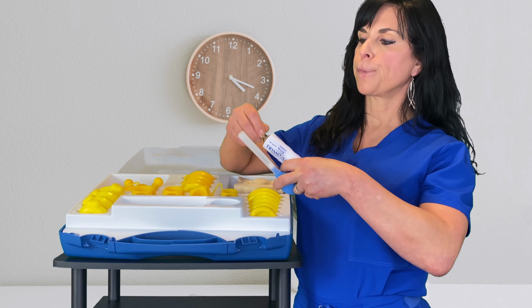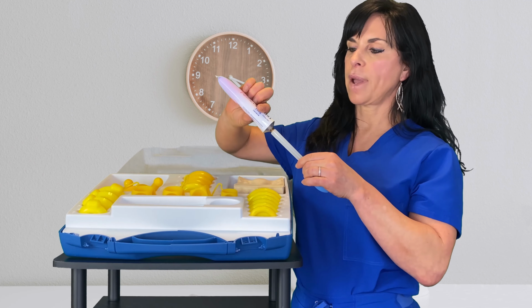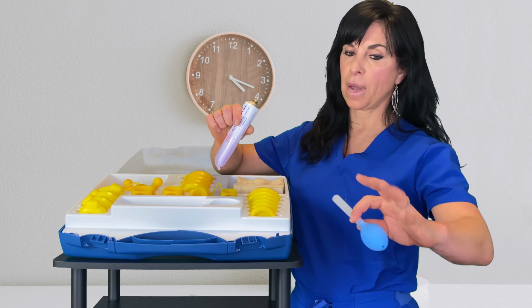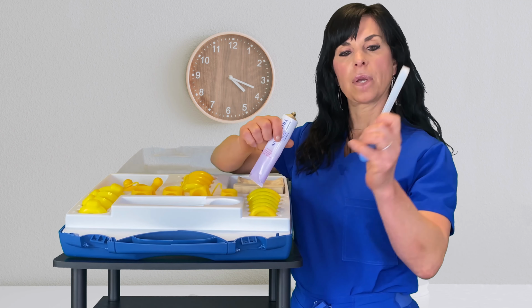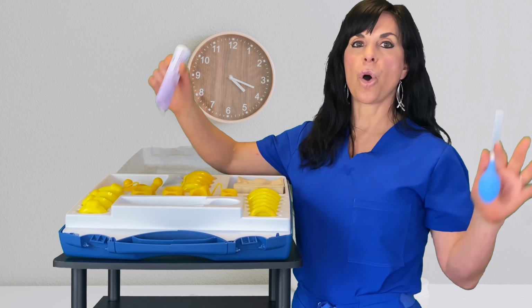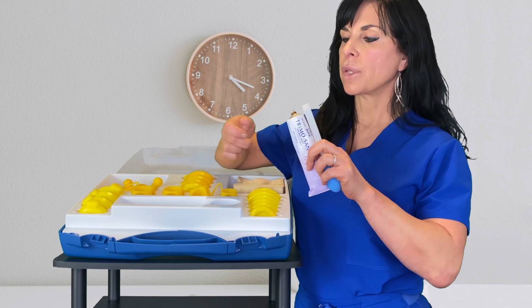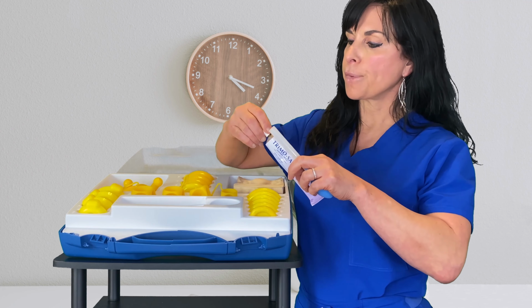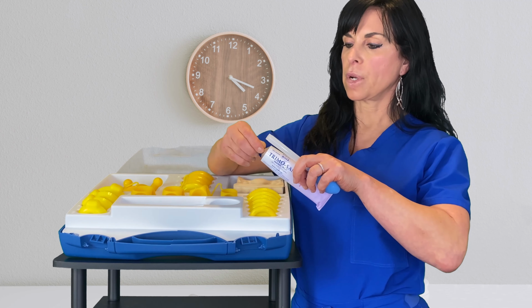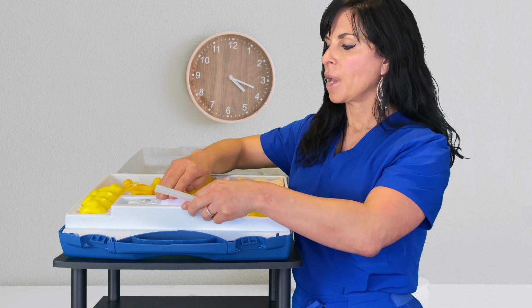The instructions will tell you to put in a whole plunger, but you don't need to. You just need to fill it halfway, and once you fill it halfway, all you do is spread your labia and insert it in your vagina and squeeze a little bulb part. Now, you don't have to get it all the way in. Just beyond the opening is sufficient. The other thing is you don't have to worry if the pessary's in there. If it's in there, go ahead and squirt it in. It's fine. It's not going to cause you harm. It's doing more benefit than harm.